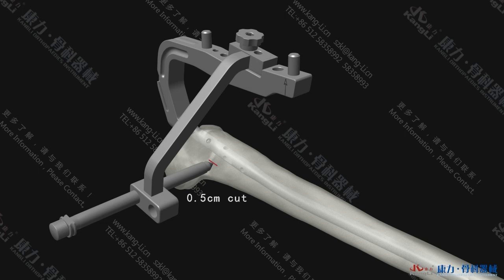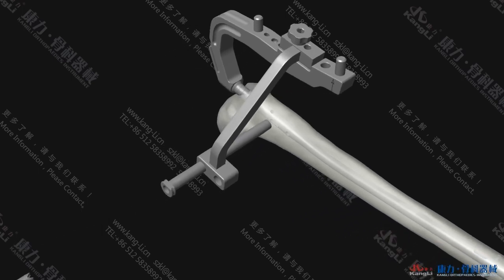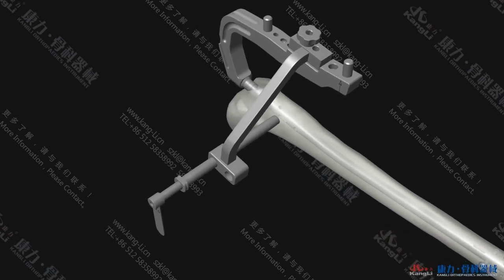Make a 0.5 cm long incision at the place where the soft tissue separator contacts with the soft tissue, and then insert the outer sleeve and soft tissue separator until the bone cortex is reached. Remove the soft tissue separator and insert the Φ4.0 inner sleeve and Φ4.0 drill bit to drill.